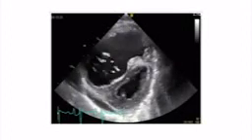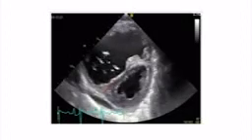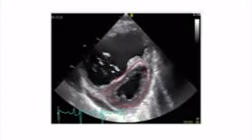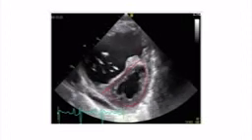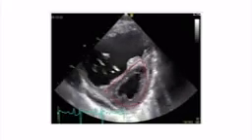Why should you focus on this part of the heart? Because when the pressures in the right ventricle exceed the pressures in the left ventricle, the septum moves towards the left ventricle and gives a D shape to this chamber. And I'll show you an example for this. Here it is actually. So an extremely dilated right ventricle, which is dealing with pressure and volume overload, and the septum, which gets flattened, moves towards the left ventricle, and this last structure gets the shape of a D.